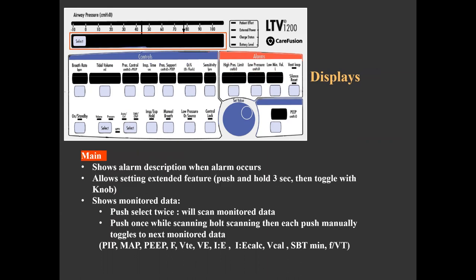The main display window and its control button serve three purposes. First, it shows the alarm description in the event of an alarm. Second, it allows entering the menu and setting extended features, accomplished by pushing and holding the select button for three seconds. Third, it shows monitored data from the patient. By pushing the select button once, the display shows data in scanning mode. If pushed a second time, the scanned data holds and the display shows a single parameter; each subsequent push manually toggles to the next monitored parameter.